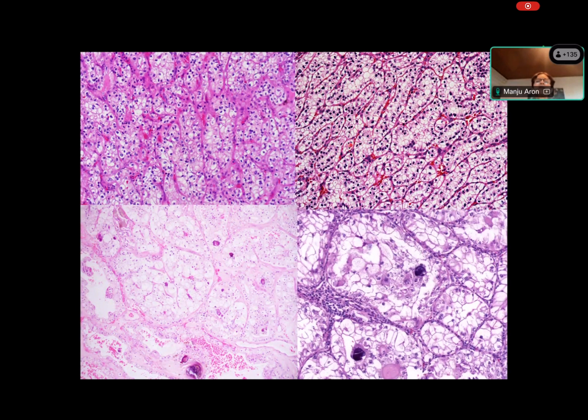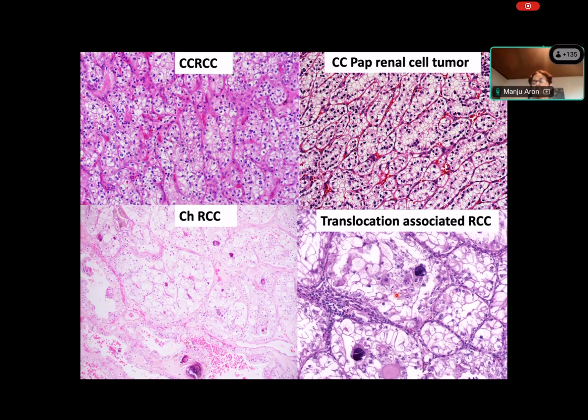Then you have here nests which have a more tubular kind of architecture with the nuclei more peripherally aligned. And again, here is an expanded nest with cells having a large amount of cytoplasm. So these are all examples of tumors with a nested pattern, and you can see there are multiple tumors that can have a nested kind of appearance.